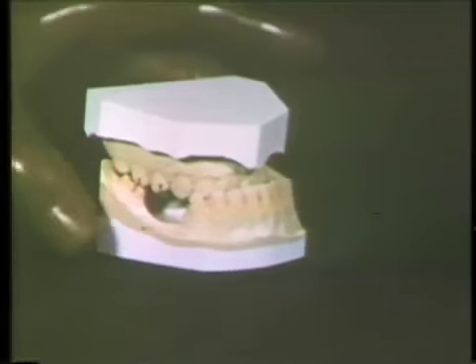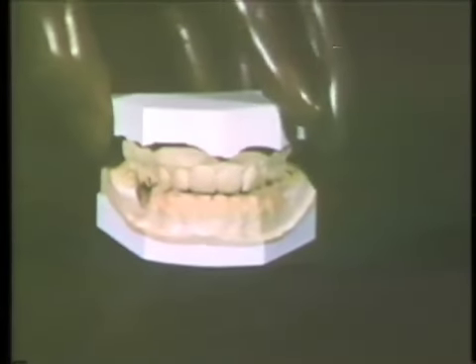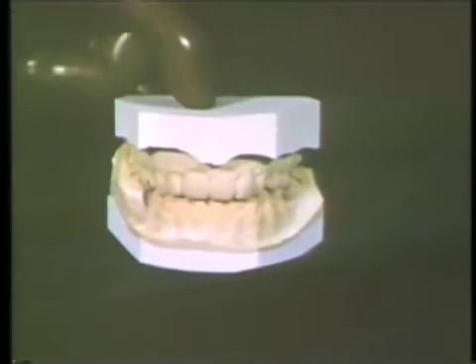Here are the related casts, and you can see the severe discrepancy and the overclosure that exists as the mandible literally telescopes the constricted maxilla. But here, with a retrusion of the entire mandible, we pick up amazingly good function, even molar contact, and it was for this reason that it was elected to shift the entire mandible backward.